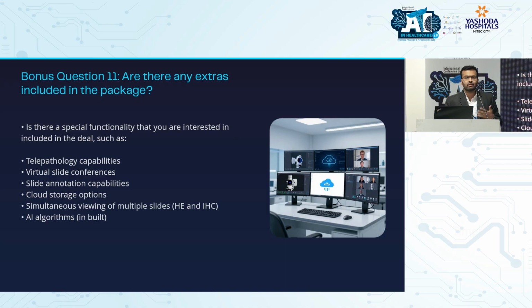AI algorithms, are there any AI algorithms that come with the application or with the software itself? Many people are launching ER, PR, HER2 algorithms inbuilt with the scanner. Ki-67 is becoming very popular. So that is something else that you need to discuss.